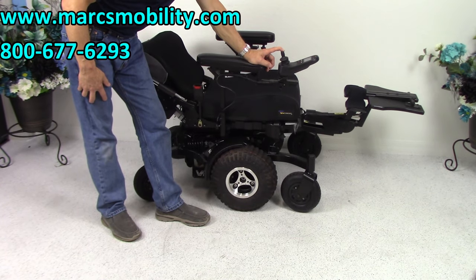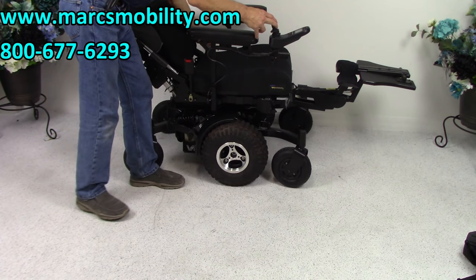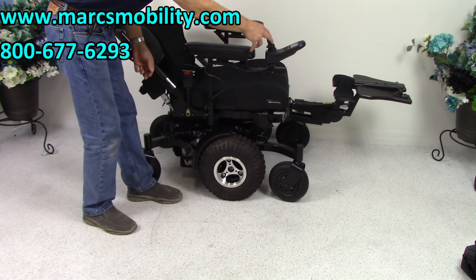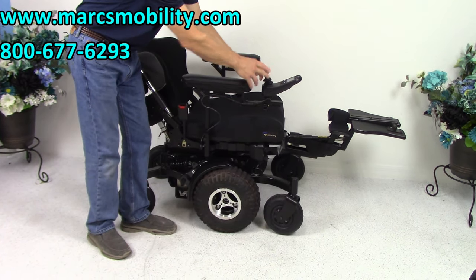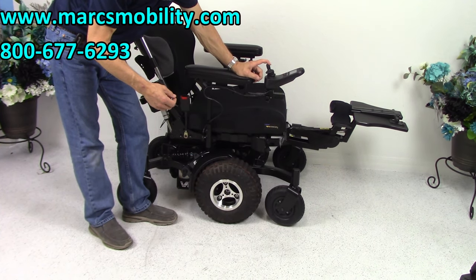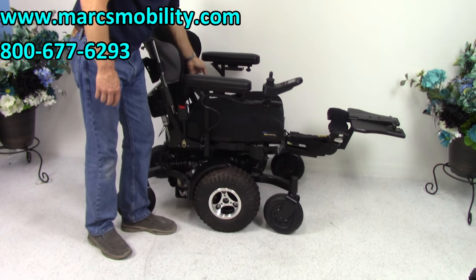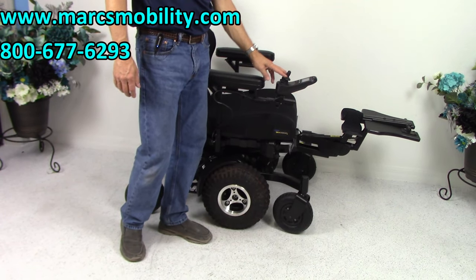While the recline comes back up, we're going to talk about the safety belt. The safety belt that comes with this chair is an automatic retract — just like in your car, it retracts. The problem with a lot of power chairs is that non-retractable straps get caught up in the actuators in the back. So this one has a full retractable safety belt.